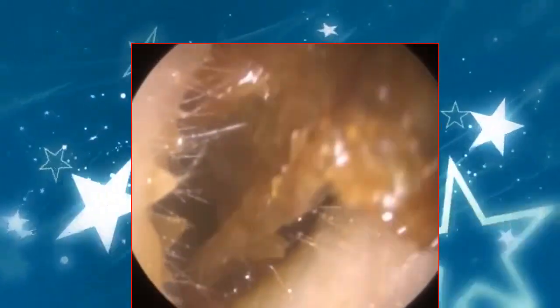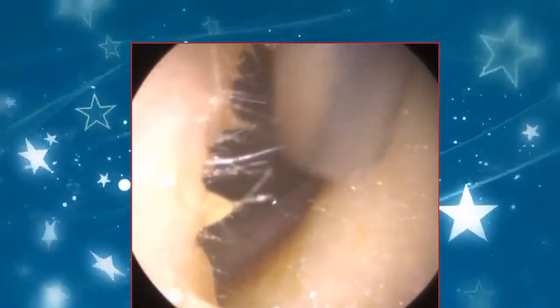So I've just put some olive oil drops in, so you can see again the first bend to the right, second bend to the left. There's a bit of dead skin there as well. So what I do with the endoscope, I position it just past the first bend, and we stretch the ear to the right, and that straightens the ear canal. You can see that little brush strokes movement. I'm just lifting this gently off the posterior canal wall, and then giving it a little wriggle, squeezing it out of the ear canal. You can see how glossy it is with the oils, giving it a glossy look.